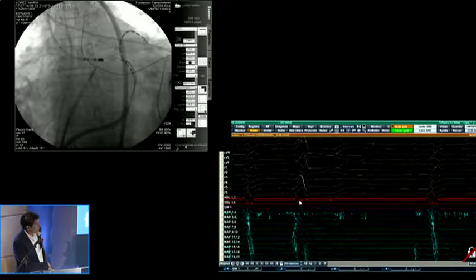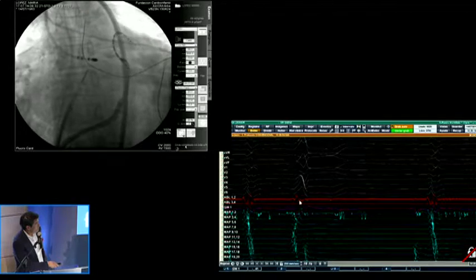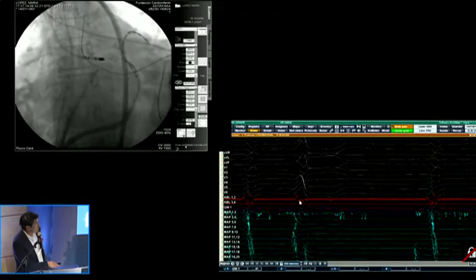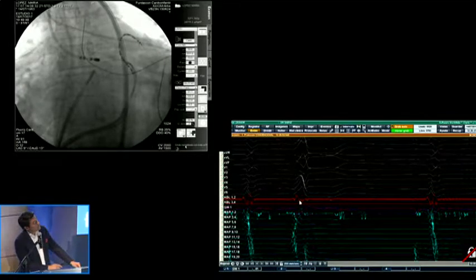Yes, we have to make some adjustments. The problem is that we have to have the wire just next to 13, 14, and it is too proximal now. I am trying to adjust the wire. The other option we had prepared, and was part of the discussion, is a very small coronary sinus. So the manipulation of the catheter has to be done through the Agilis, but once we are there, the impedance will be high and difficult to apply from the vein. We prepared that for the discussion because we have half normal saline available in the room.